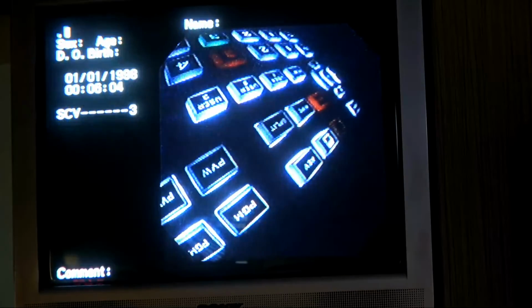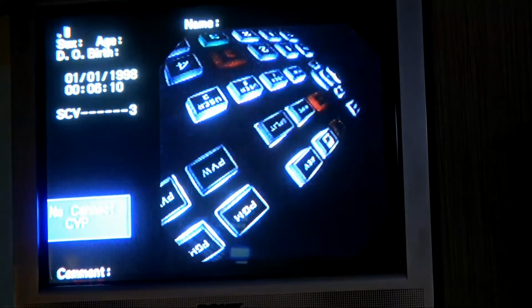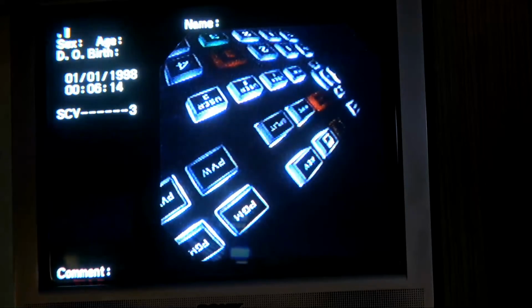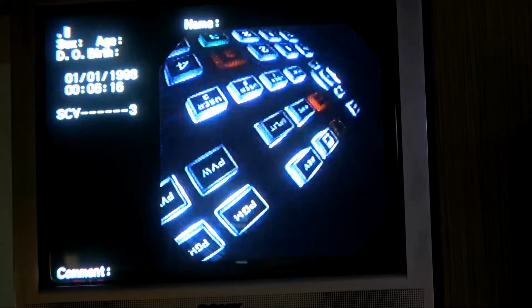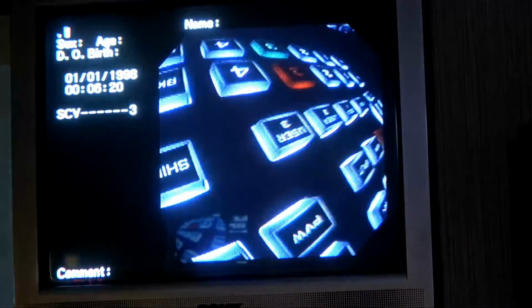And in that button number 4, what I have done, I think no connected color video printer. So it is not connected, otherwise it will do. And if I want to unfreeze, I will press 1 again and it will unfreeze. So it has a lot of functionality.